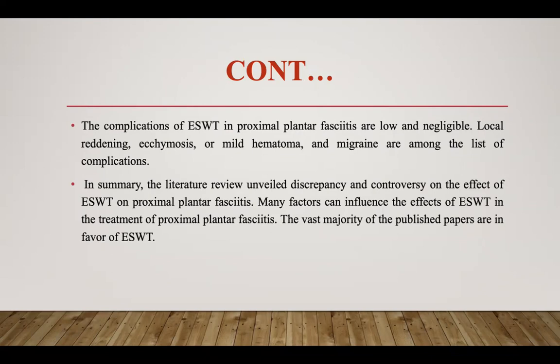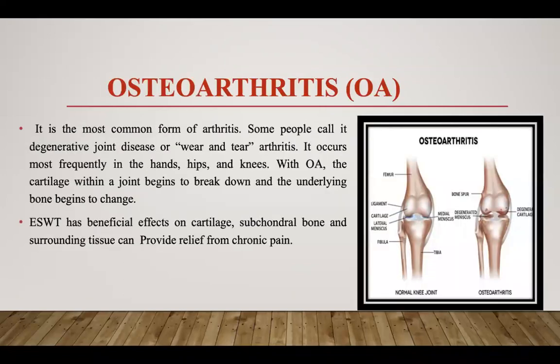In summary, the literature review unveils discrepancy and controversy on the effect of extracorporeal shockwave therapy on proximal plantar fasciitis. Many factors can influence the effect of extracorporeal shockwave therapy in the treatment of proximal plantar fasciitis. The vast majority of published papers are in favor of extracorporeal shockwave therapy. Let's move to the last clinical application. So many are present, but this one is the last on screen.